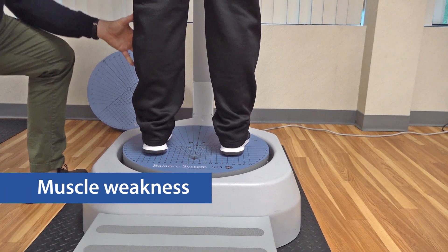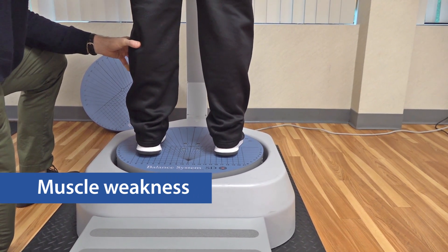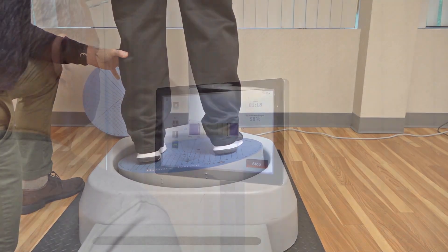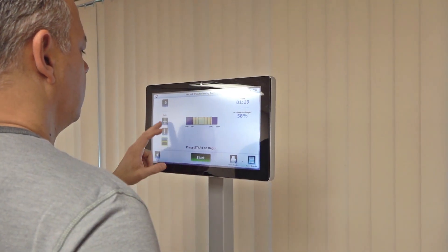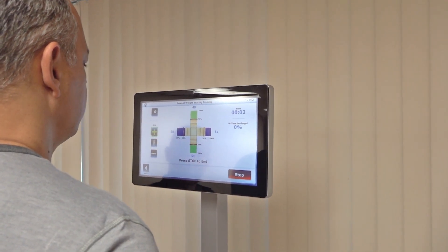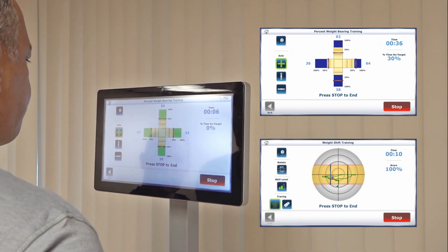A patient who has undergone a total hip replacement experiences significant muscle weakness on the involved side from the surgery and general disuse of muscles. One of the first things we want to do is to regain symmetry. Utilize various training modes to increase motor activity and improve strength and endurance. The percent weight bearing and weight shift training modes on the balance system are recommended.